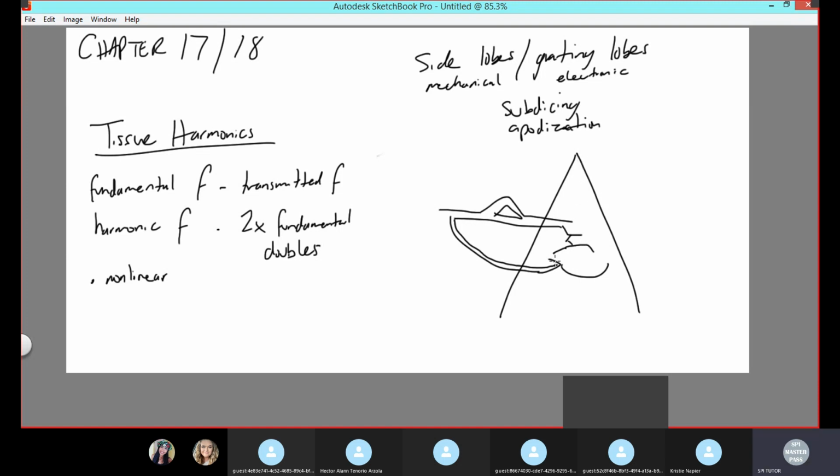So what ends up happening is that this tissue is a high reflector and it's on the side of the image. So because this tissue is a high reflector, just like how I said, that's one of the criteria, and it's on the side of the image, this is going to create a little extra reflection that the machine is going to assume is right down your main beam axis in the center. So what it does is it takes that little piece that reflected very highly from the side and puts it in the center. So it just duplicates it and puts it in the center.